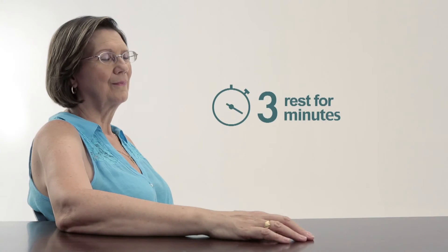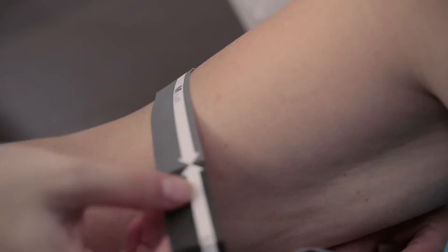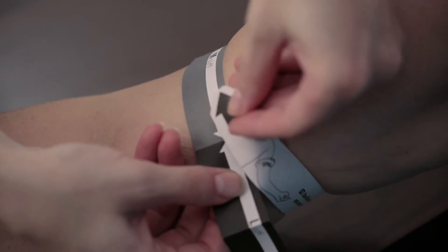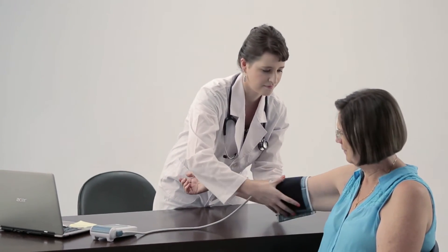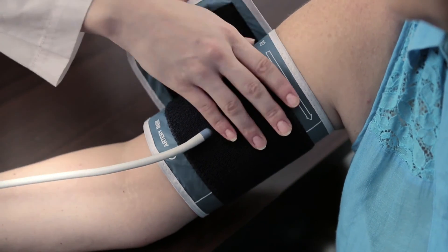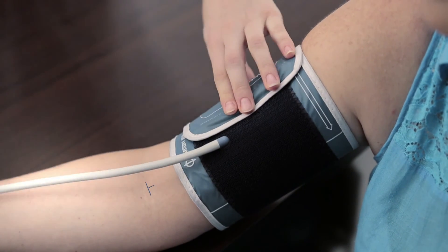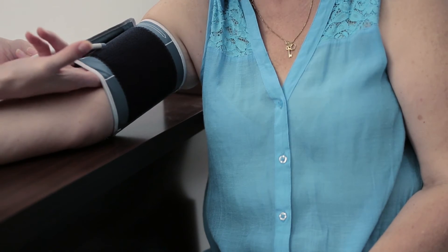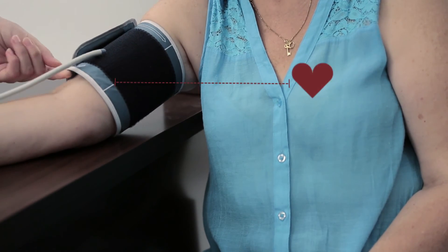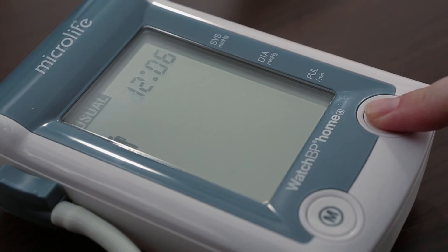Take 5 minutes rest before beginning blood pressure measurement. Choose the correct cuff size. Make sure the lower edge of the cuff is exactly 2-3 cm from the inner fold of your arm. The tube connecting the cuff to the device should be placed on the inside of the arm. Ensure that the cuff and arm is at the same height as your heart. Press the start button.